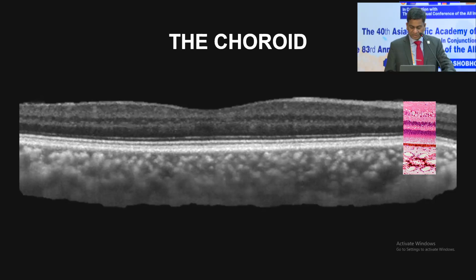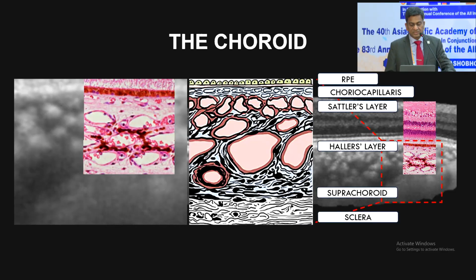So just to give you an idea about the choroid, it was not till 2012 that we were able to image the choroid as well as we can do it now. And these were the early days of the choroid.